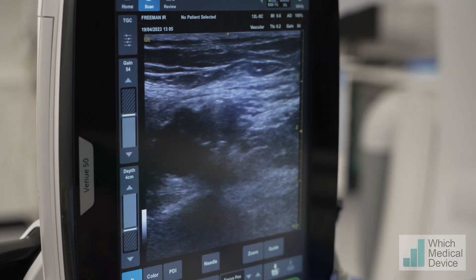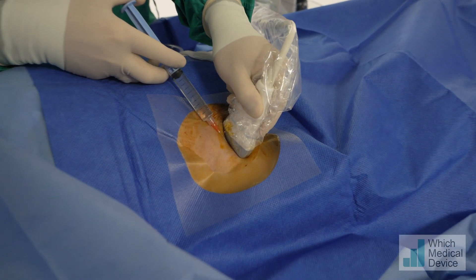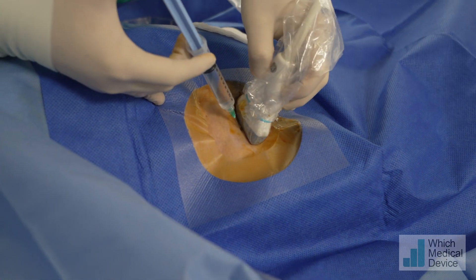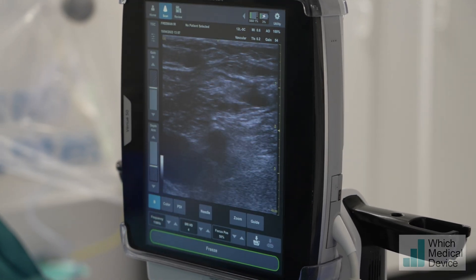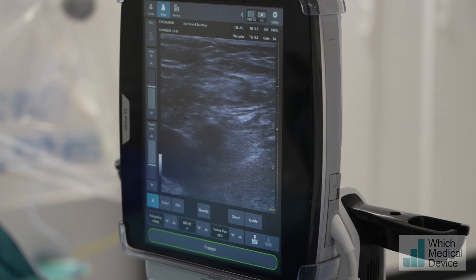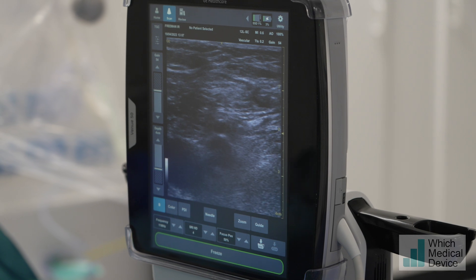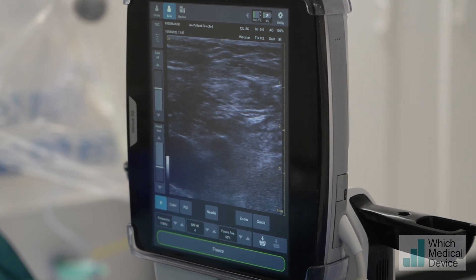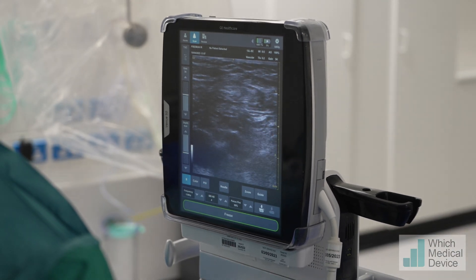Ideally we puncture at the higher side over the femoral head. There'll be a sharp scratch coming in just now - sharp scratch, sorry. Just giving you some more anesthetic there. So that's the anesthetic going right down to the anterior wall of the common femoral artery. You can see the separation of the artery and the tissues there.